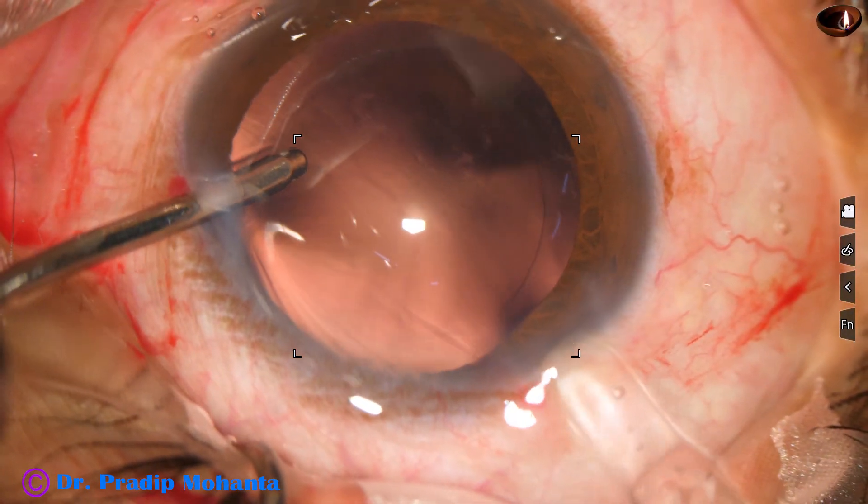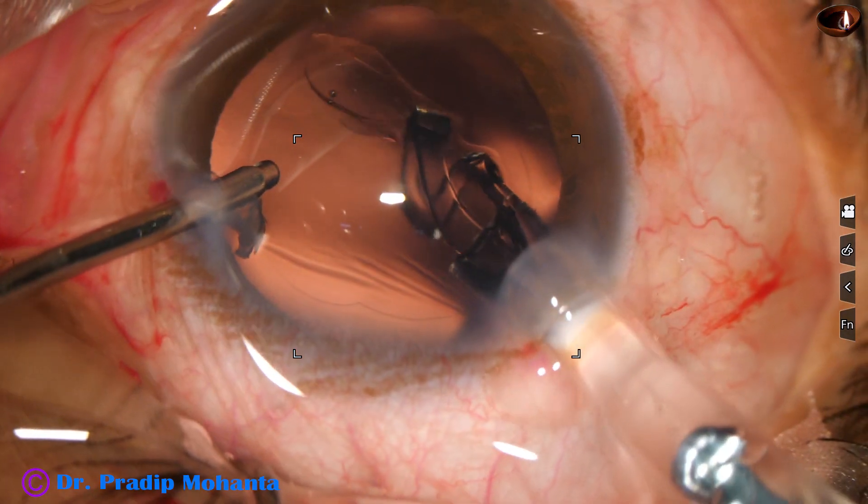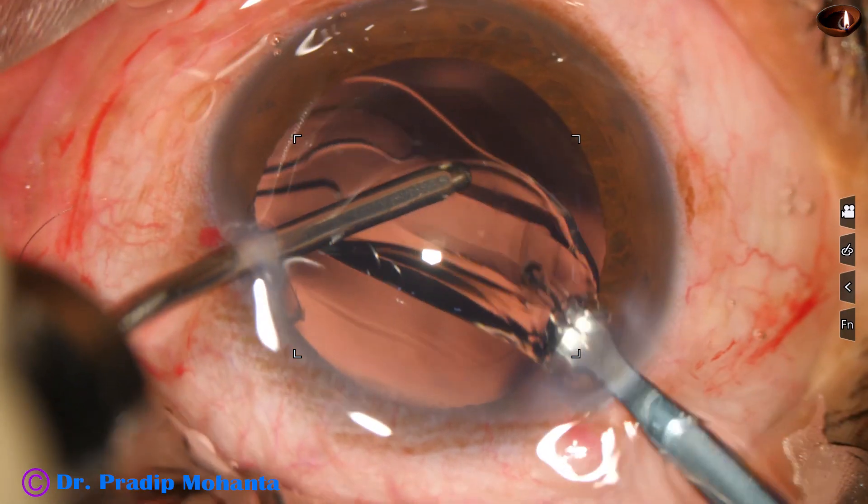This is also a hydrophilic acrylic lens. Let us see this one — how it opens. This one is opening very gently.